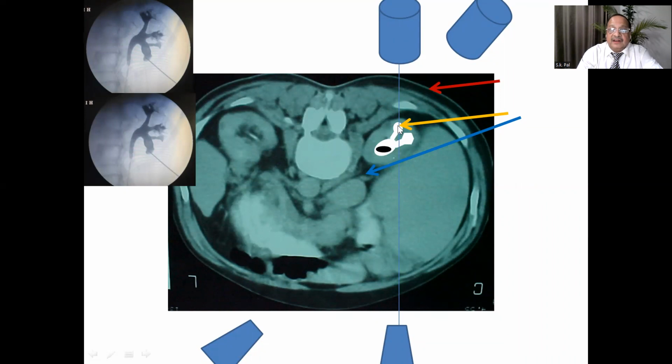And this is the needle which will be seen on the target whether the C-arm is at 30 degrees or at 0 degrees, and if this needle is seen at the target in both, then we are at the target. But I will repeat, once you shift from 30 to 0 degrees and your needle tip which was seen at the target at 30 degrees moves lateral to the target, you are superficial.